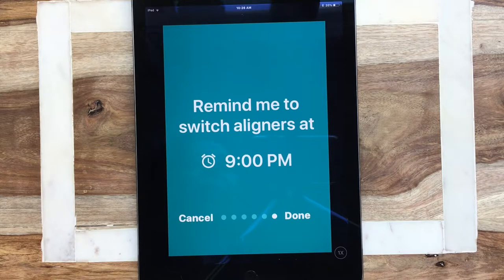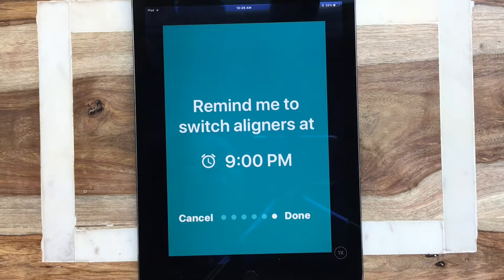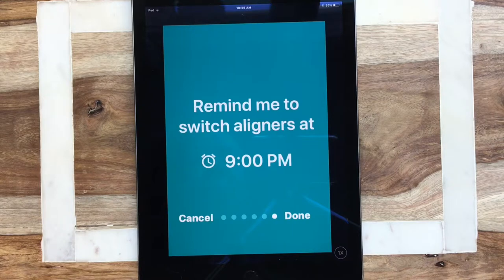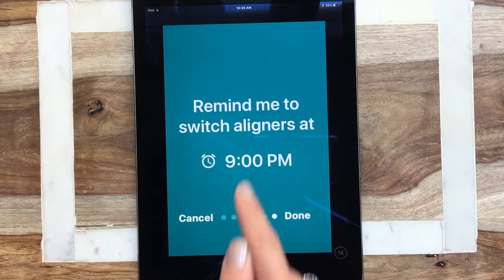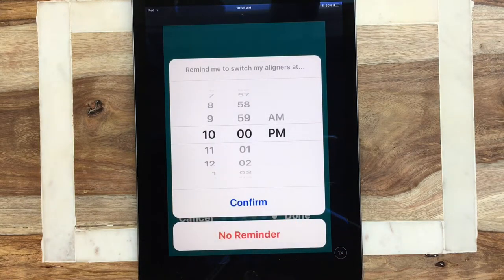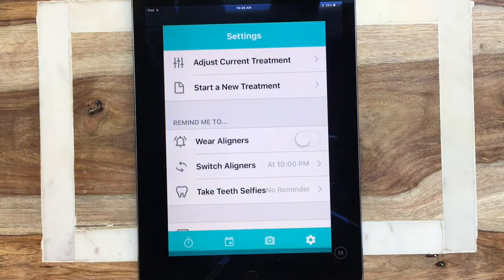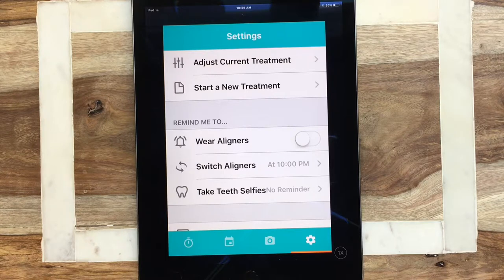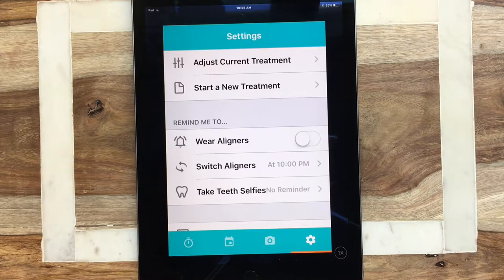The 'Remind me to switch aligners at' feature reminds you to switch to a new set of aligners. I typically recommend that patients switch at nighttime because it's more comfortable and you'll go through a little less discomfort. Let's say you sleep a little bit later — say 10 p.m. — so confirm and go done. If this is your first time setting up the app, it's going to ask if you want to receive notifications, and you do want to say yes, because that allows the app permission to send you reminders.